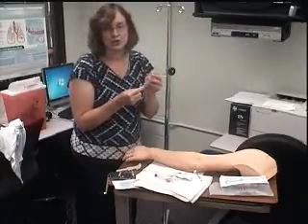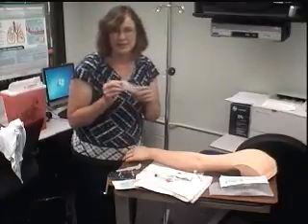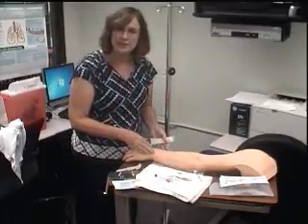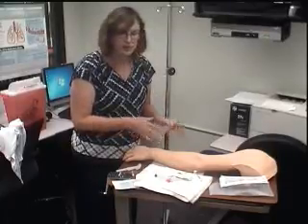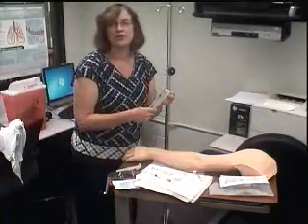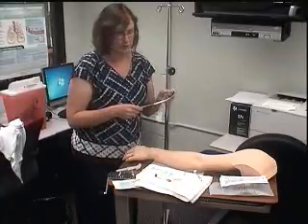You could bring 2. After 2 sticks, I say probably just not your day. Get somebody else to try and stick that person, because if you keep sticking and you keep blowing that vein and you just keep doing it, you're going to run out of spots. And there's only so many spots in the arm. So after 2, I usually say, okay, I'm done. I'm letting somebody else do this, whether it's another nurse on the floor, or whether I have to call IV therapy to come and get it up.